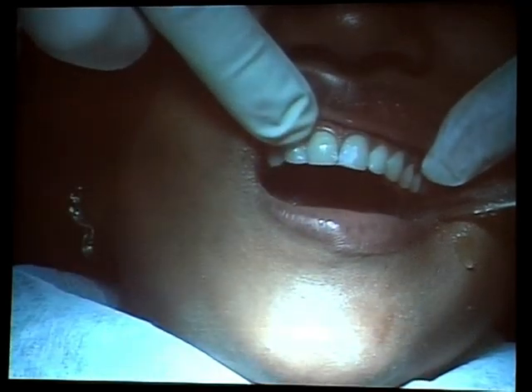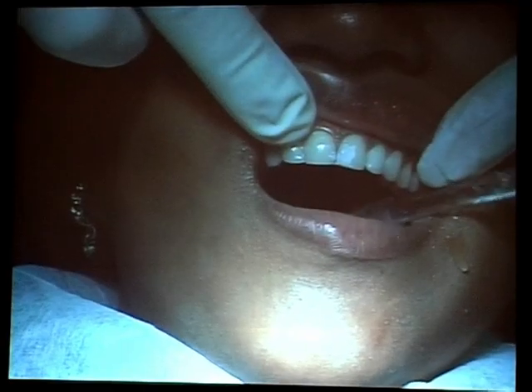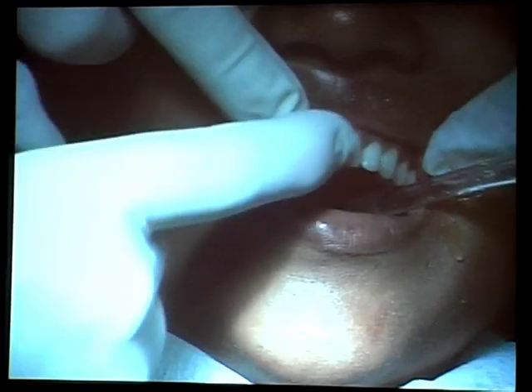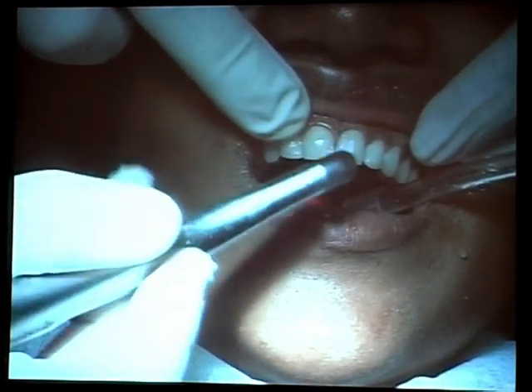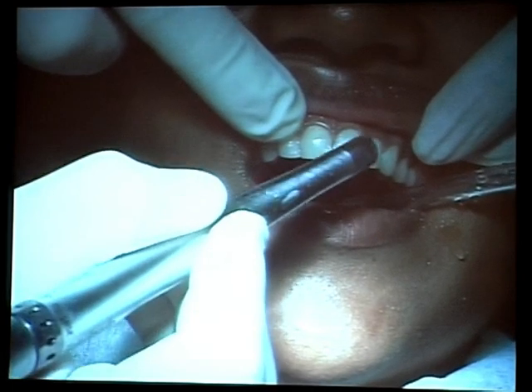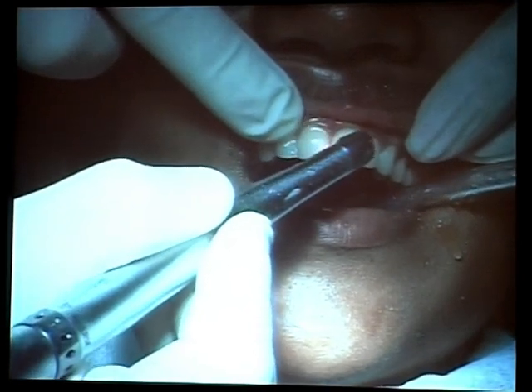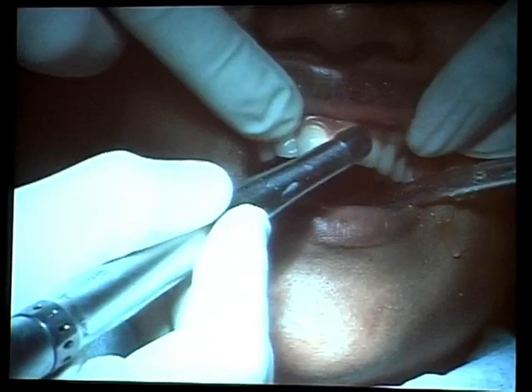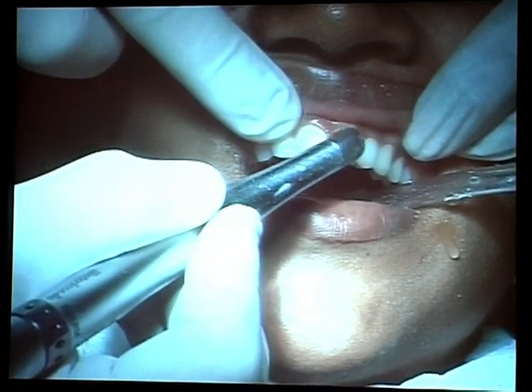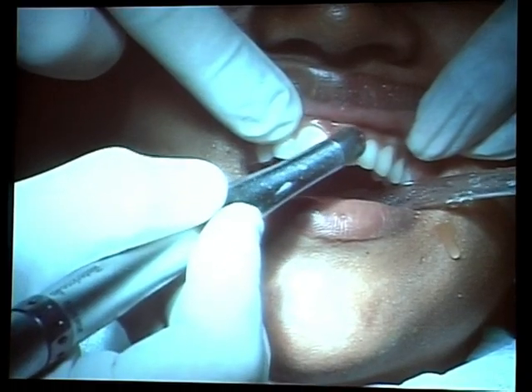Now you can already see the patterns from the lasing. It's whitish all over. But the advantage of using a laser is something called laser analgesia, which happens automatically.